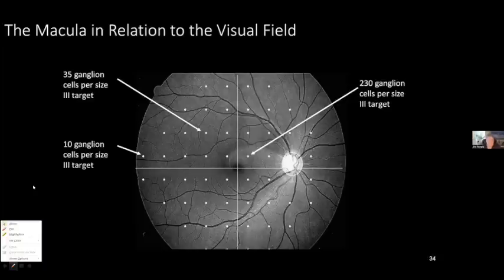Okay, let's move on to some of the visual field images that you were speaking about. Well, I have not so much the visual field images, but I did this more from an anatomic perspective on how to approach the neuro-ophthalmic and glaucomatous visual field. So I don't have visual fields per se. I have more the strategies of what would be going through our mind in choosing a visual field or using a visual field to help localize the problem. Okay, if that's okay. Sure, please. All right, then let me run through.